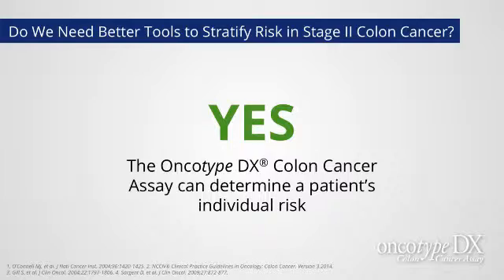You've worked with this, Dr. Wheeler. Yeah, so as you said, we've talked about a number of histopathologic features mentioned in the NCCN guidelines that we use as pathologists to help guide treatment. And obviously, none of them are accurate and consistent enough to be able to use any one histopathologic feature. So it's nice to have some kind of molecular analysis, and in this case a genomic signature, which can be paired up with the histopathologic features.